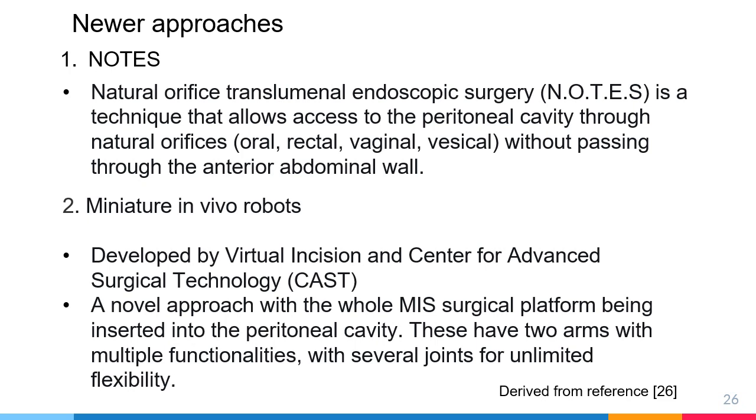These robots allow surgeons to image the surgical site from many angles and to complete the surgical task on site or remotely. These are inexpensive and easily transportable, allowing minimally invasive surgery to be done anytime, anywhere, by almost anyone, from outer space, the battlefields, or remote medical emergency situations.